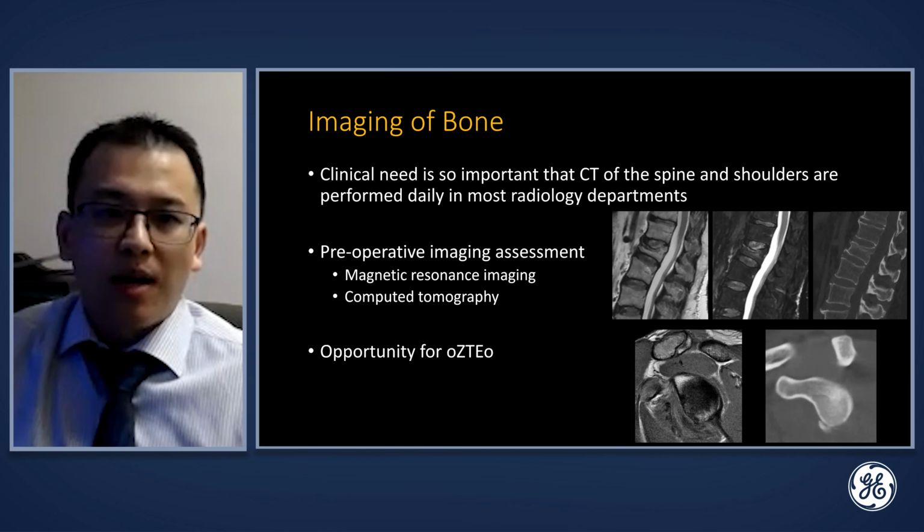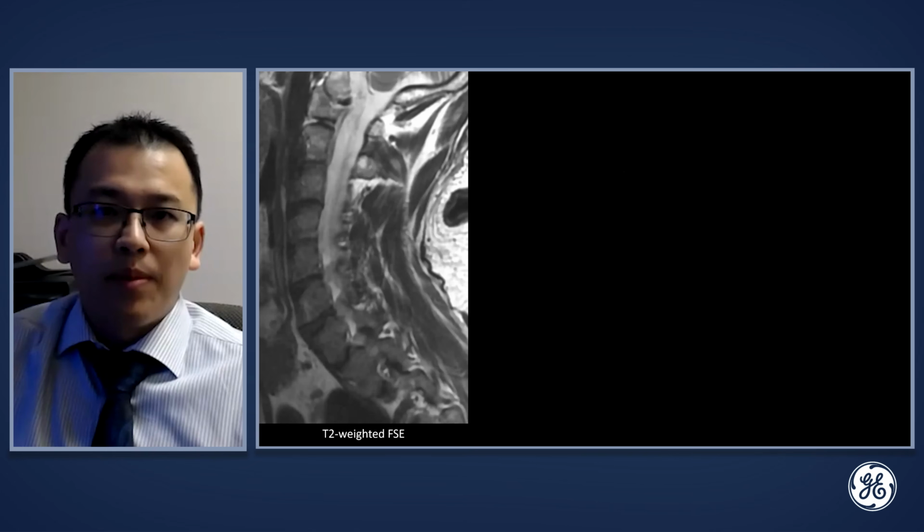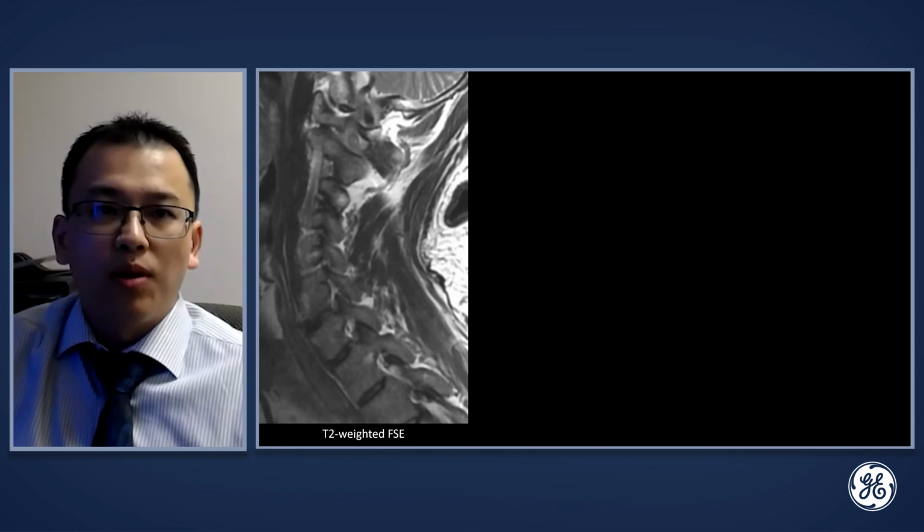This is a great imaging opportunity for oZTEo. For potentially operative cases, we can use oZTEo to make MRI a one-stop shop. Let's jump into some cases to illustrate this. Here's a case of a 55-year-old man with chronic neck pain and myelopathic symptoms. We're scrolling from right to left.